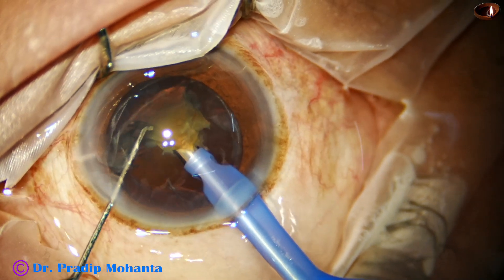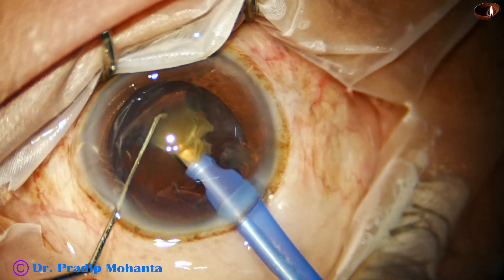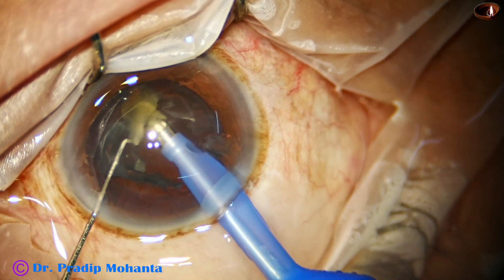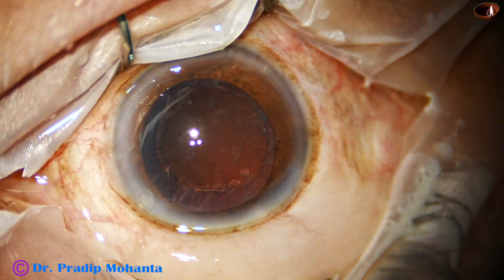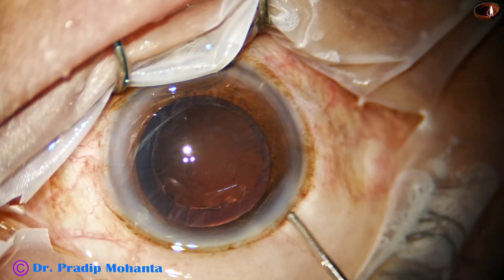During this part — emulsification of the last bit of the nucleus — vacuum is 300, flow rate is 35, and ultrasonic energy is 70%. So, we have managed the nucleus nicely, and now we are going to clean the cortex.